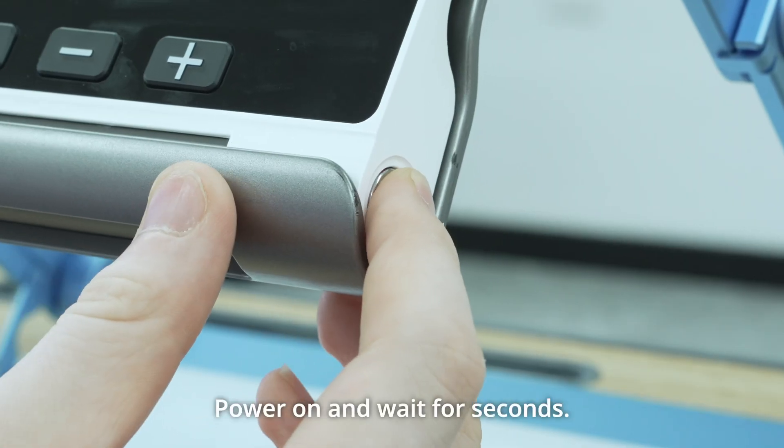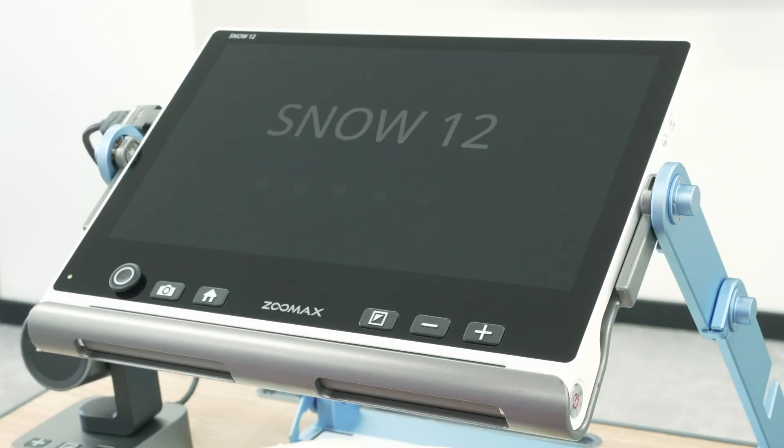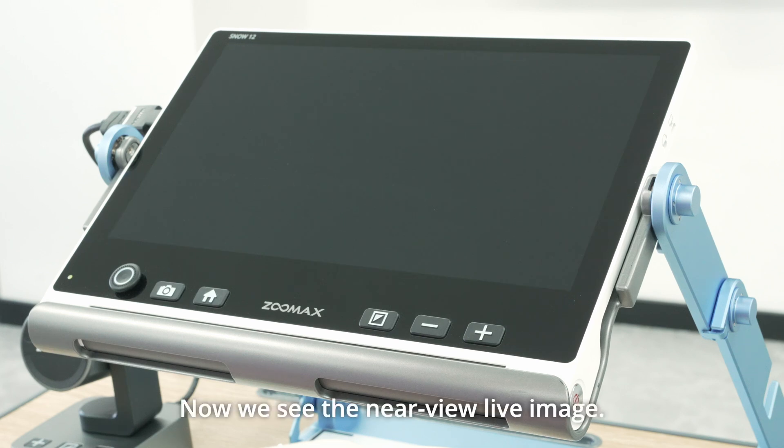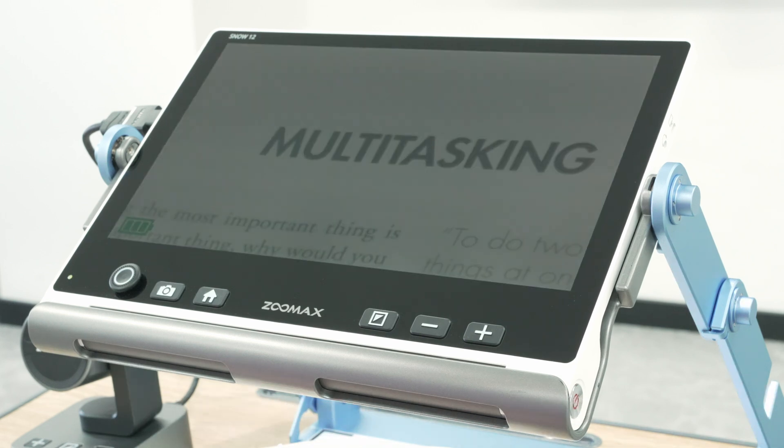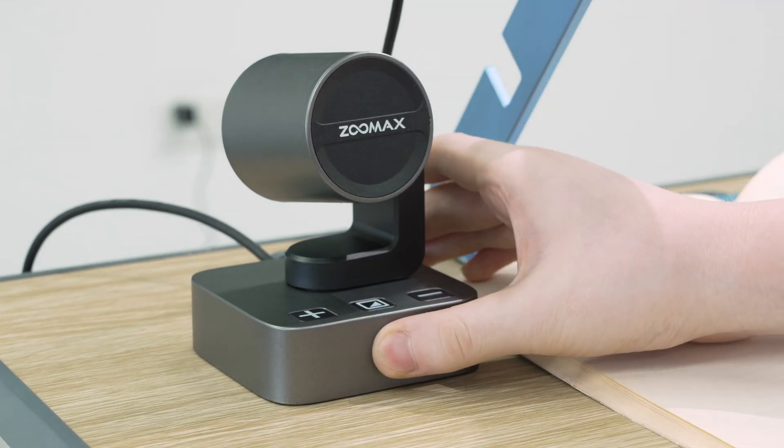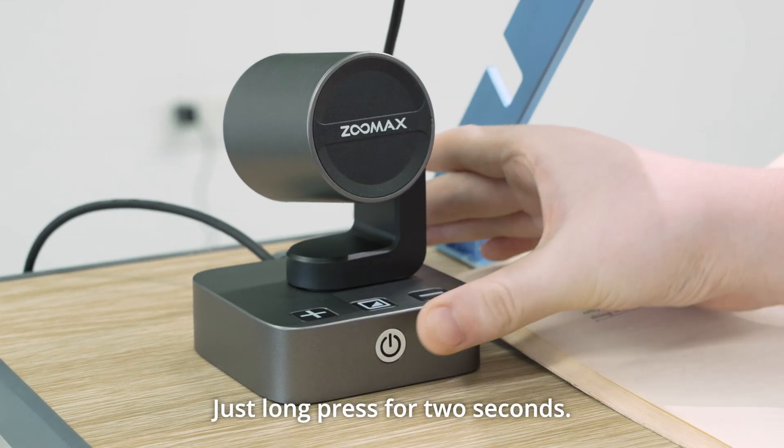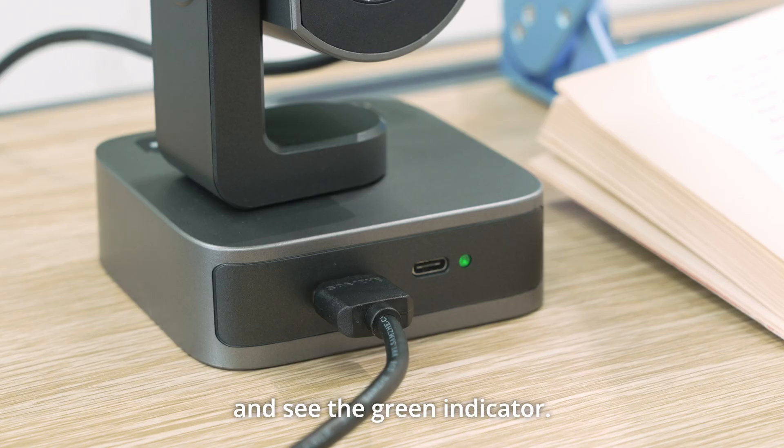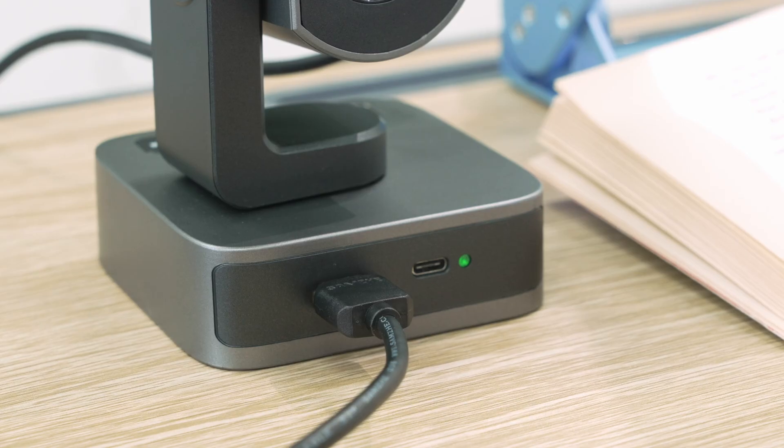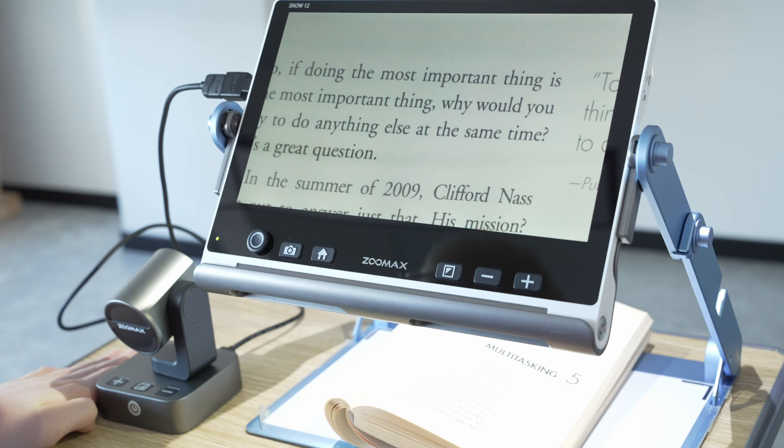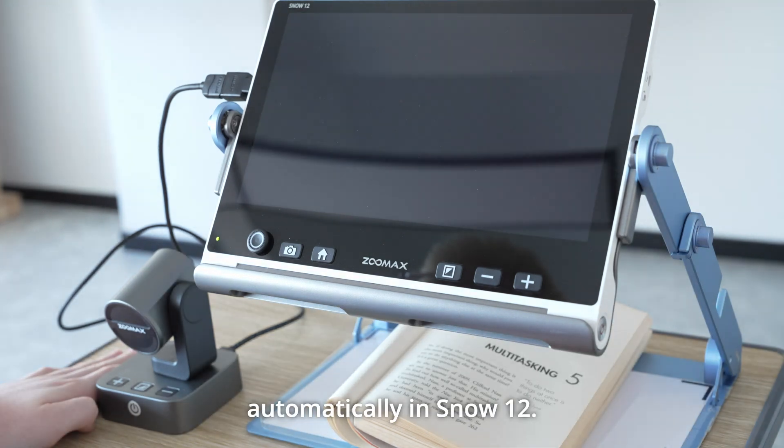Power on and wait for seconds. Now we see the near-view live image. Then power on Snow Eye. Just long press for 2 seconds. You hear the beep sound and see the green indicator. It switches to distance view automatically in Snow 12.